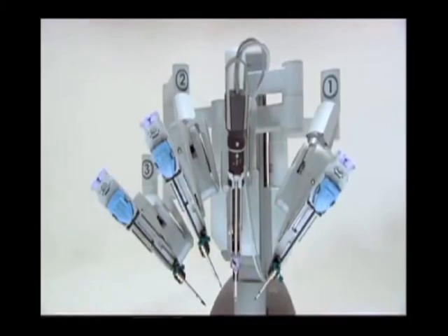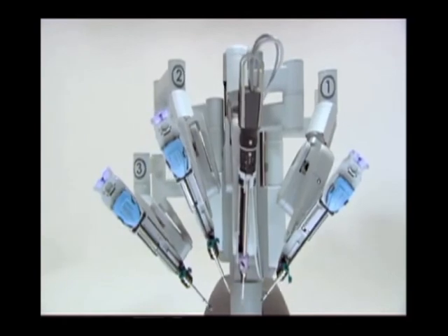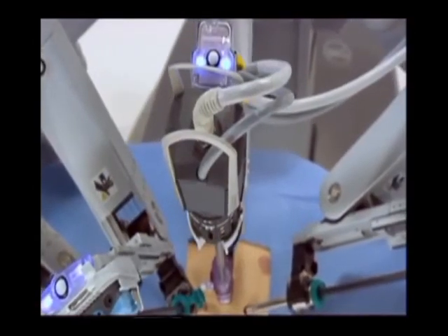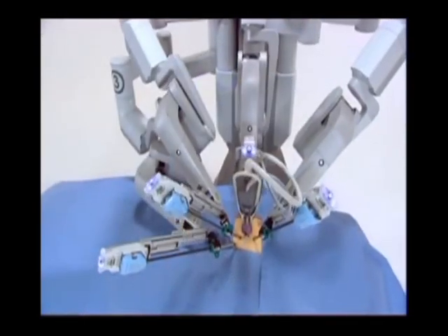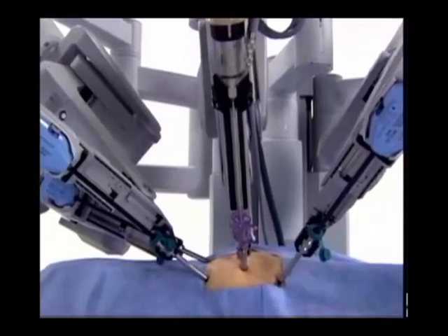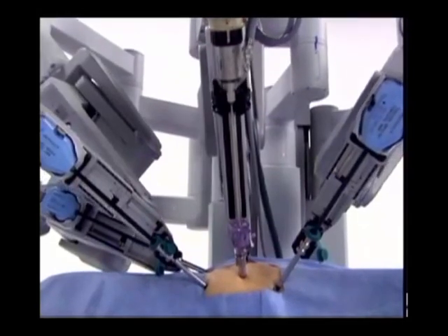Each arm is $1,000. Yeah, that's what makes it a bit expensive. They actually need about 3 or 4 arms in one operation, and those are discarded. They're disposable. So when you talk about doing a prostatectomy at 6,000, if, for example, he'll use 3 of them, that's 3,000 for those pieces. Obviously, with more production, as people develop more, that cost will go down. Yeah, so that's why it's a bit expensive. Okay, so about 1 million.